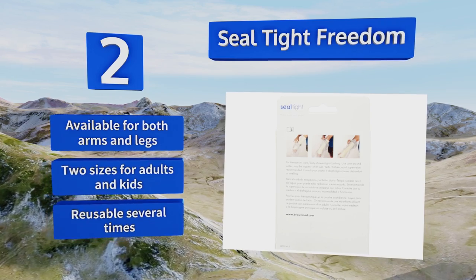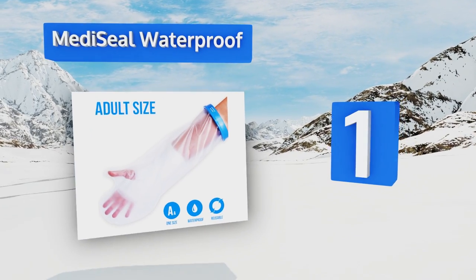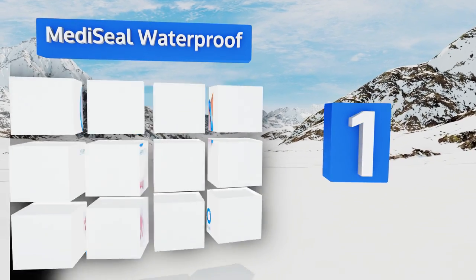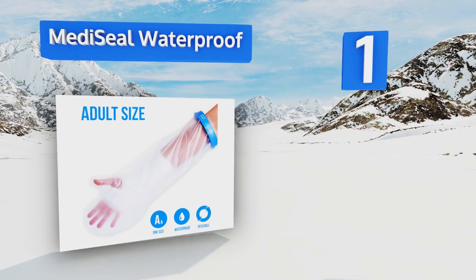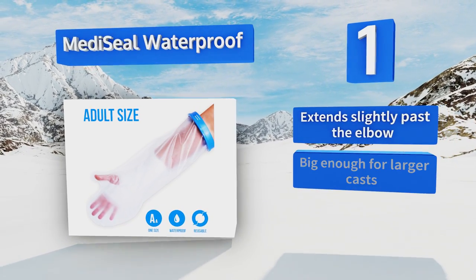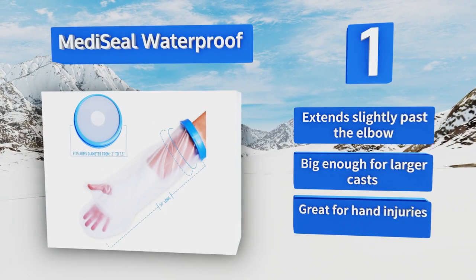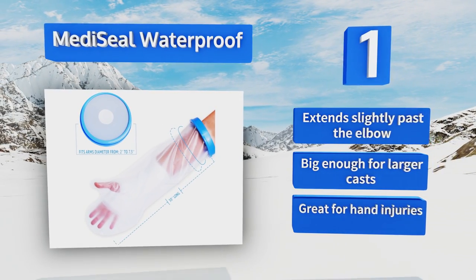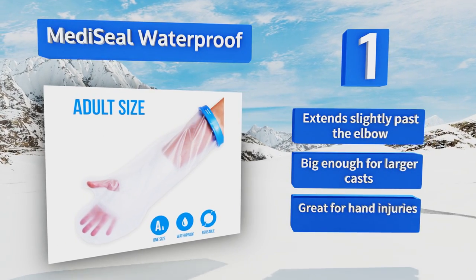Taking the top spot on our list, the Medicil Waterproof is made of a mixture of PVC, polypropylene, and rubber, which makes it feel sturdy without weighing you down. That also means the cover itself can be easily washed in between uses, so you won't have any worries about bacteria. This one extends slightly past the elbow, is big enough for larger casts, and is great for hand injuries.